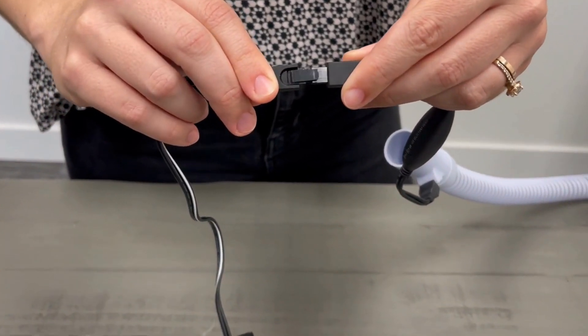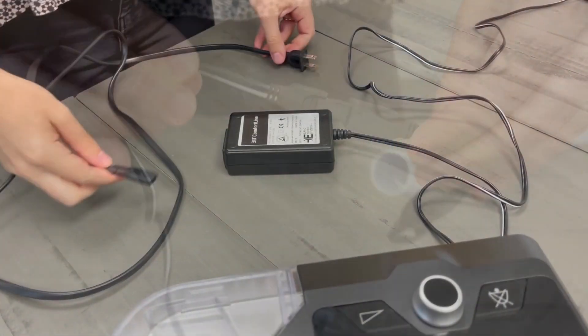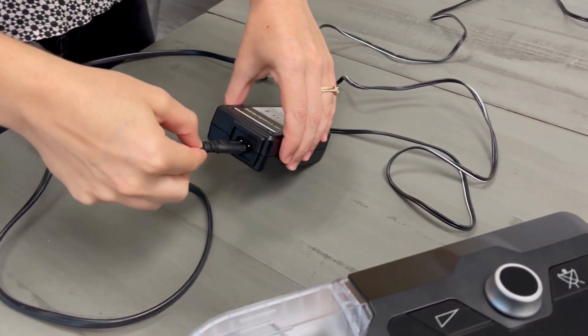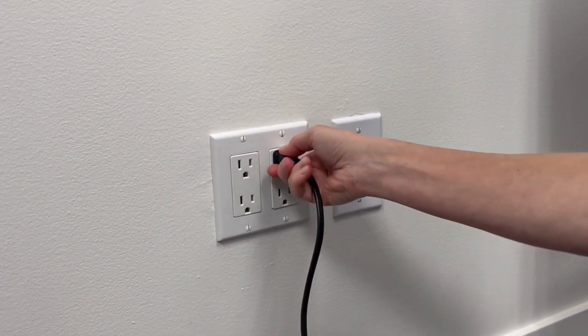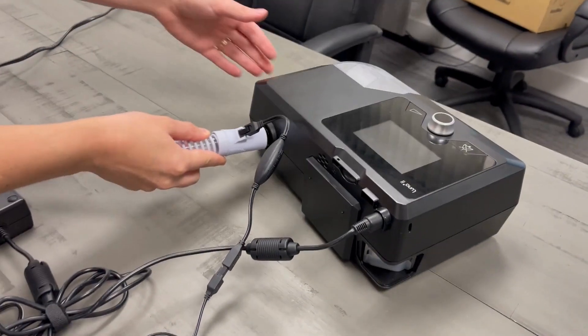The power cord will be plugged into the tubing adapter, then into the power source. Finally, the cord will be plugged into the wall and the other end will plug right into the back of the unit.